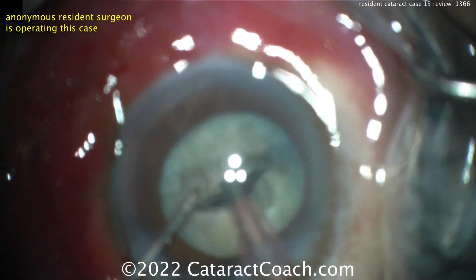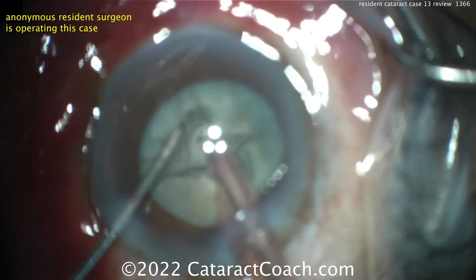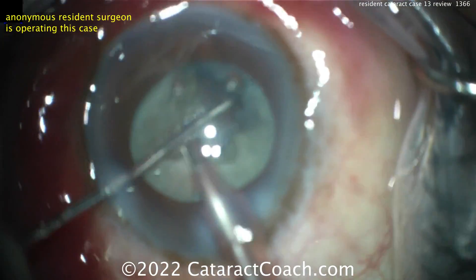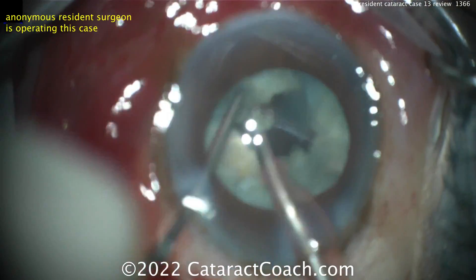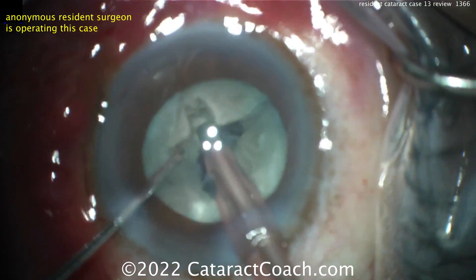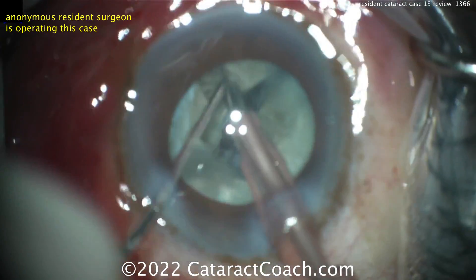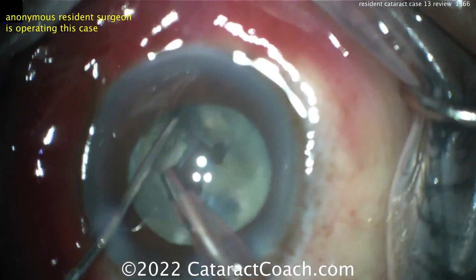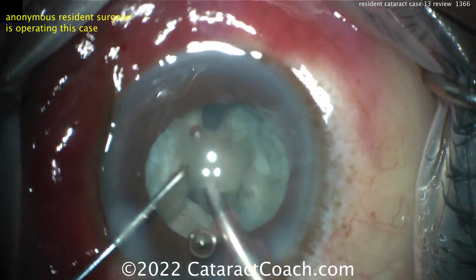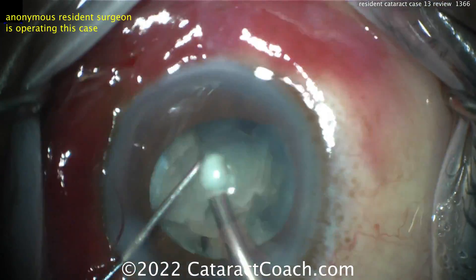I'm having a hard time believing this is case 13 because the skills are quite good. Look at that crack and then the rotation immediately — this case is going beautifully. That's a good divide and conquer. Either this surgeon has done 1,000 prior SICS or manual small incision surgeries and has good hands because of that — and this may be the 13th phaco case in that scenario. Or if this is a U.S. resident, there's no way it's your 13th case. But hey, that's the fun of these videos — to learn.